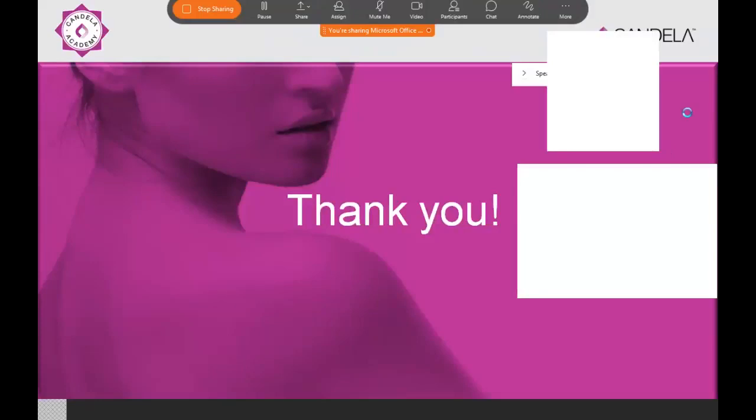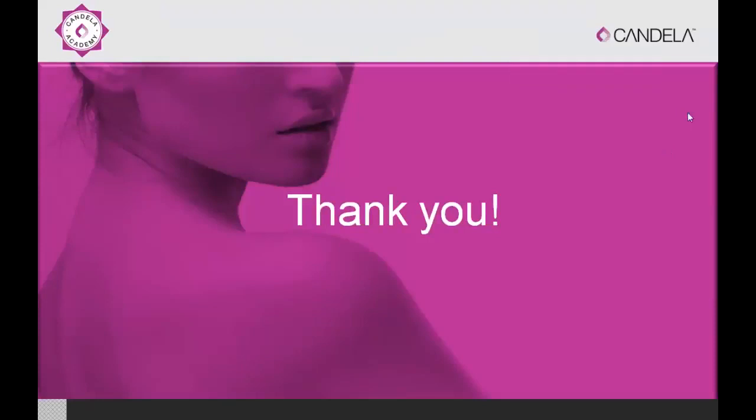Okay. So there is one question about changing the depth of the LIOBs and the impact on the results of wrinkles and acne scars. That's a very good question. It is not so much the depth of the LIOBs as it is the number and size of LIOBs. And that is why we do multiple passes with higher energies, to get larger and more numerous LIOBs, and that gives us more of a wounding effect.